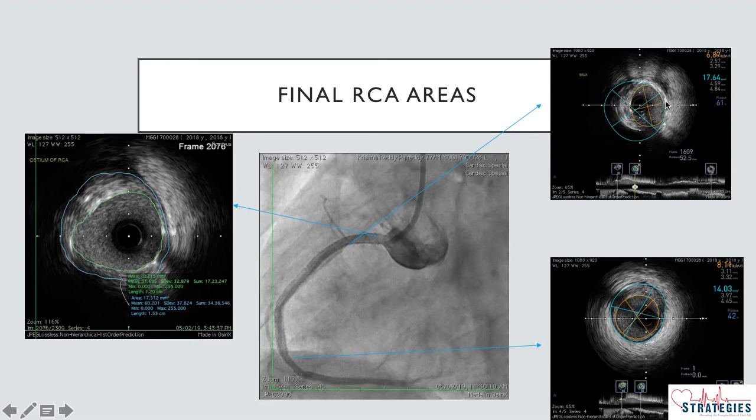stent. In such a case, as you can see, the plaque is completely on this side and there is no plaque on this side. When you try to expand to more and more pressures, sometimes you may create perforation, because the stent tends to expand only in this direction. So never try to dilate. If the plaque is uniformly around the vessel, then you can go to higher pressures slowly and expand the stent. But when it is eccentric, never try to over expand, you may end up in perforation.